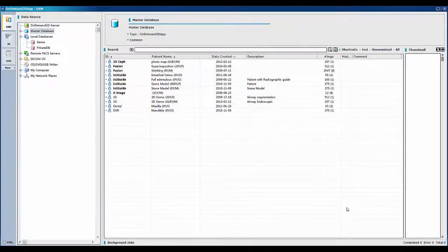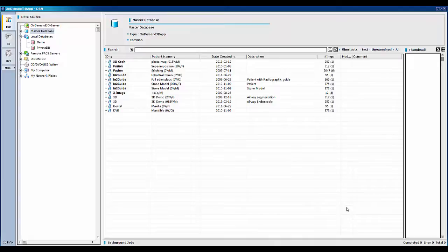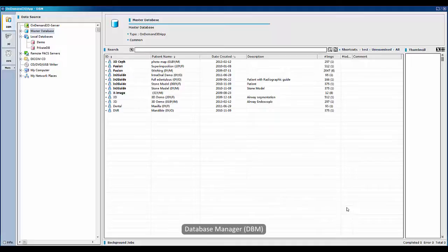Welcome to the video tutorial on On-Demand 3D software. This video will cover database manager, also known as DBM module, particularly license manager, license information, and shortcut keys.